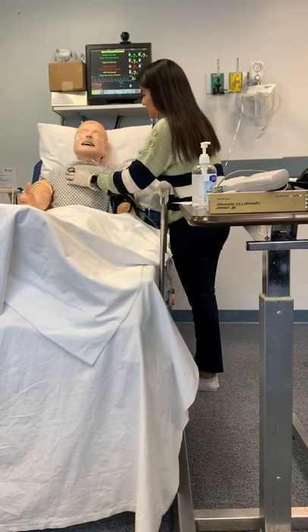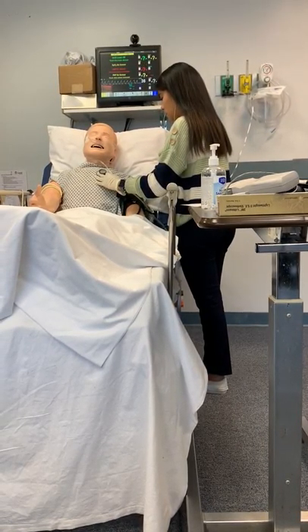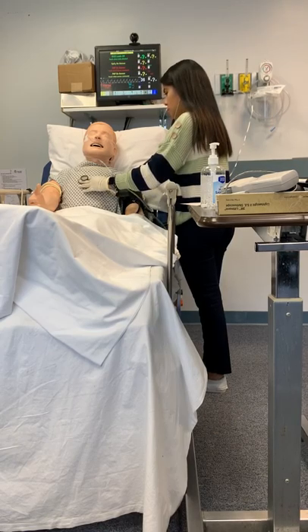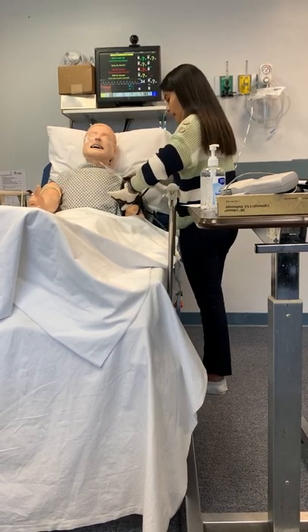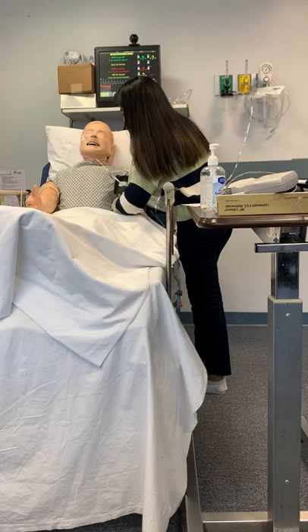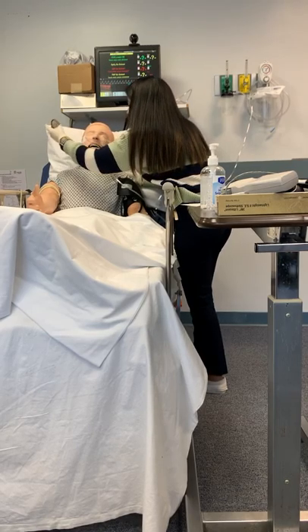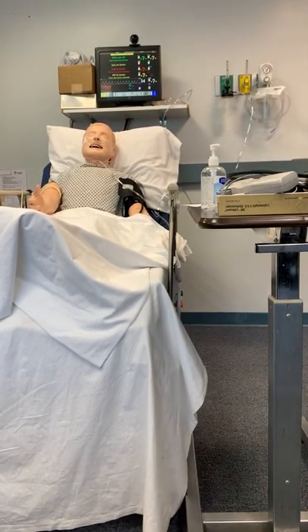Take deep breaths in and out of your mouth for me. I'm going to lift you up a little so I can get to the back, okay? Perfect. Back here. We'll go on that side. Just going to borrow your wrist, okay?